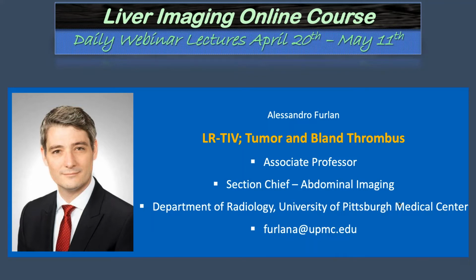Definitely if you have some Y90 treatment, the morphologic changes and the heterogeneous enhancement changes that occur in the area of treatment, especially in the first phases after treatment, may be different than on TACE or radiofrequency ablation.